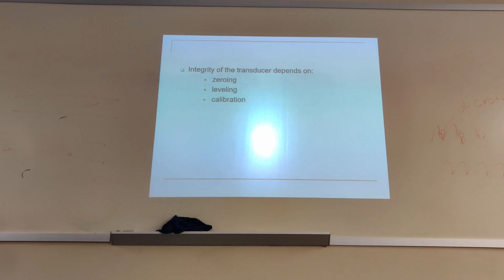And then the next thing is calibration. Okay? You have to calibrate your transducer. Calibration is nothing but taking a known value and putting it into something, and then expecting that thing to read back what you put in. Like, if I want to test my transducer to see whether it's measuring accurately, I can plunge in a pressure of 5 in here, and then see whether it reads 5. If it does, it's calibrated. If it doesn't, then you're going to have to tweak it and make sure that it reads 5. That's calibration.